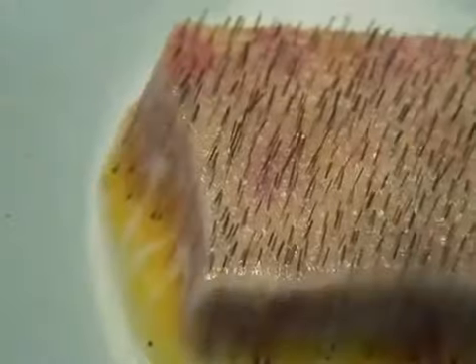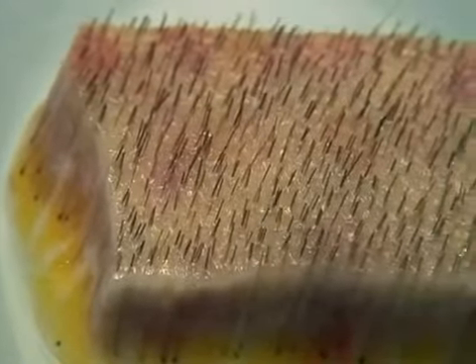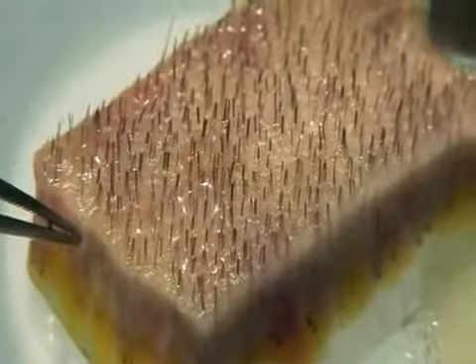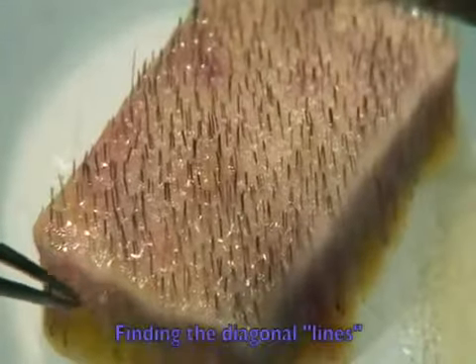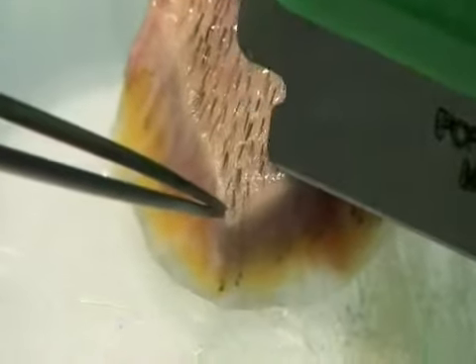When we see the donor strip, we can easily find diagonal lines — that is the arrangement of the follicular units into the hair. So if we can find these lines, it's going to be easier to prepare intact follicular units.